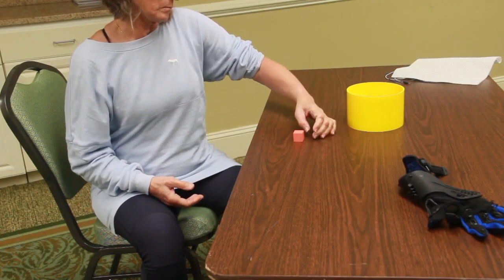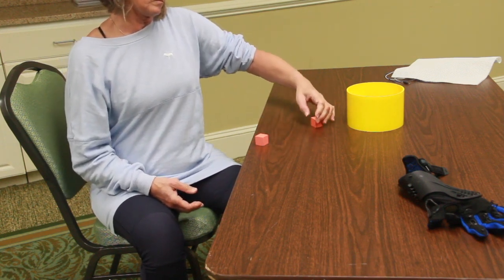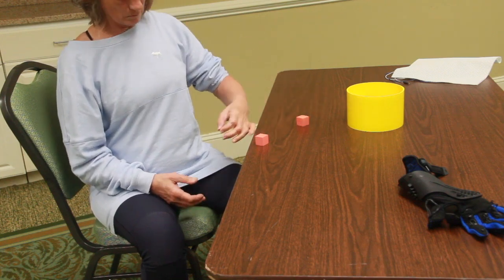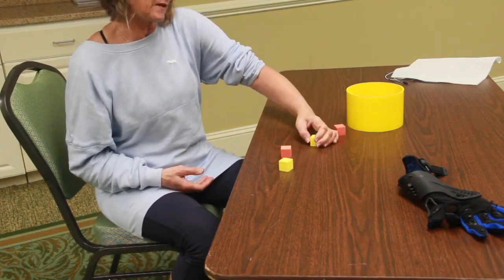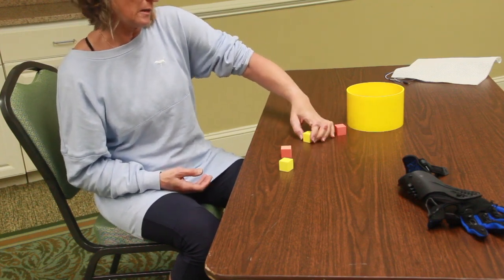We have a young lady who suffered a stroke and exhibits minimal spasticity, so she's a perfect candidate for the Saebo Glove versus the Saebo Flex. As you can see, she is unable to grasp and release the blocks, but her hand is relatively loose. So we're going to go ahead and fit her with the Saebo Glove.